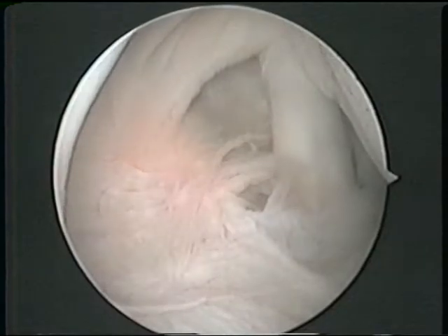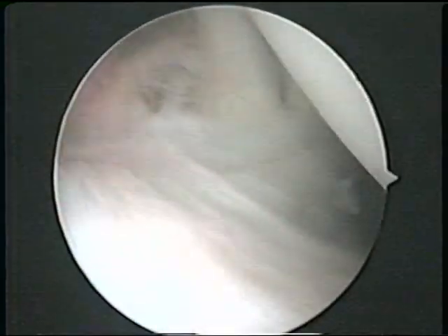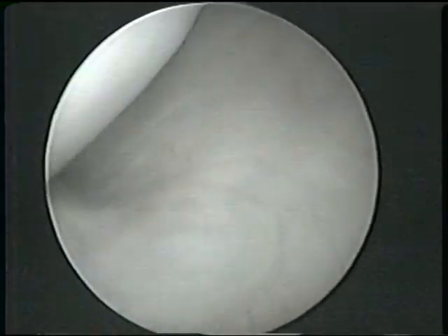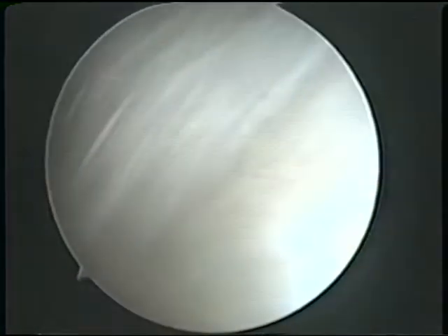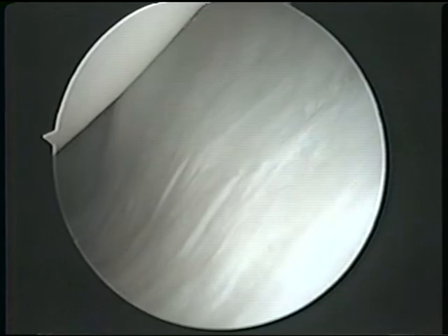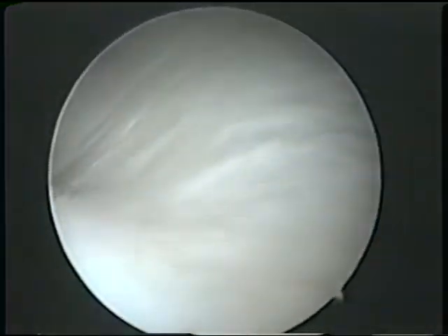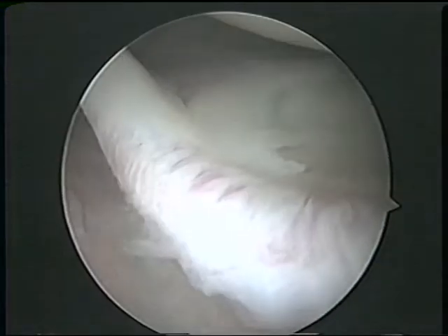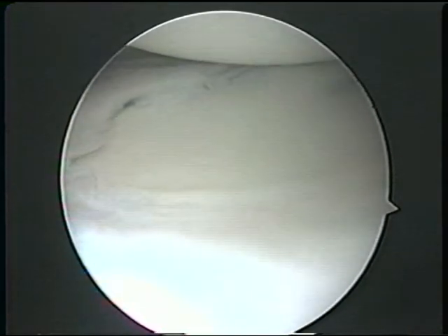The procedure of shoulder arthroscopy requires you to be on your side with your arm up in the air. Your shoulder is examined right after the anesthesia is given. Once the examination is complete, small stab incisions are made and fluid is run into your shoulder to distend the joint. The arthroscope is then placed into your shoulder from behind.